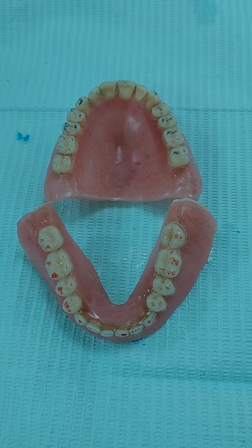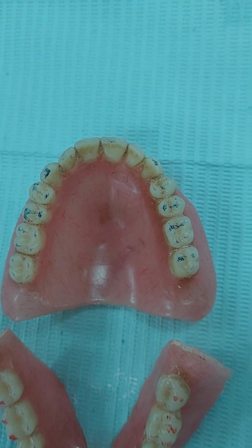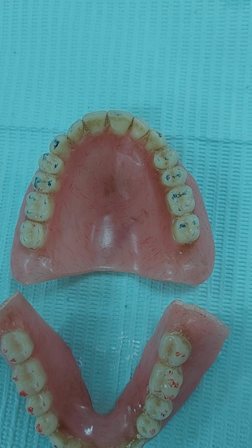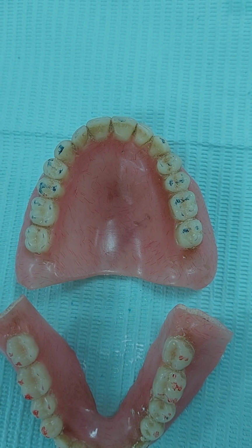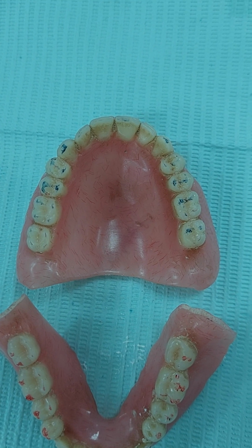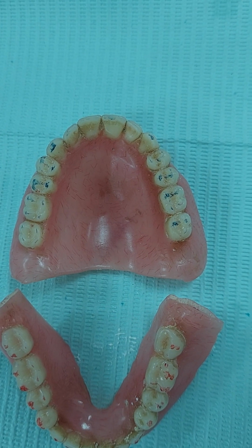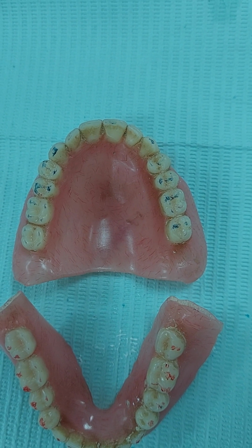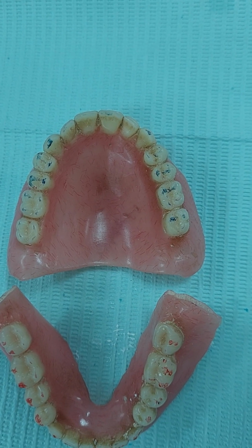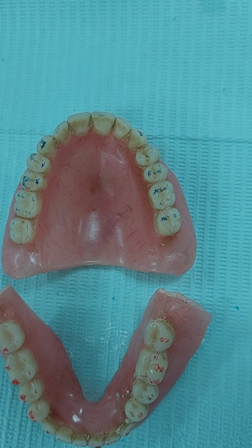I would accept that the buccal cusps are hitting here, taking that the non-functional cusps here are only touching. But what do we have? We also have uneven contacts with the upper. You see the 6 and 7 on the left side that I'm seeing, which is the right of the patient. These two teeth are not taking any bite. They're taking very light contact on the 7, something equal on the 6. Now, what we see on the 6 is what we should see on all teeth: even contact, functional cusp, non-functional cusp at excursions.